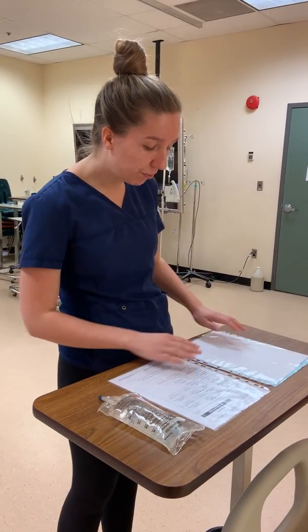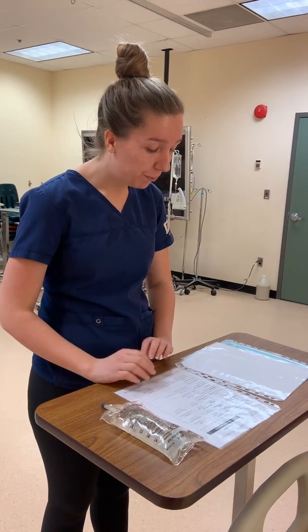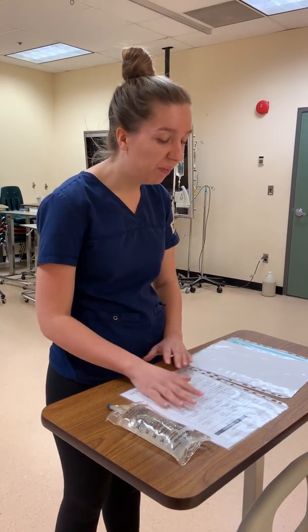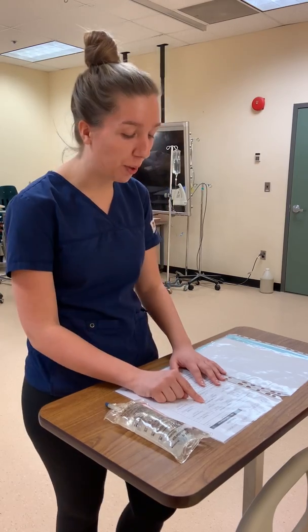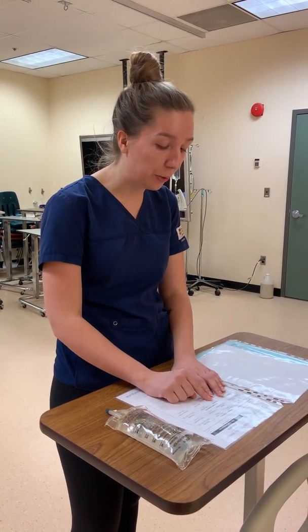Now going over to compatibility, I can see it is compatible with normal saline, which is important to take note because that is my current carrier. Potential hazards to be aware of are bleeding and thrombocytopenia. Now looking at the IV continuous Colleague pump table, I'm specifically looking at heparin VTE because that is what my patient has. So when applying dose mode, I need to use units an hour.